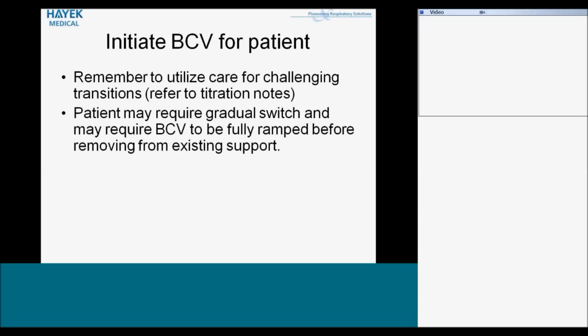So if you've got a patient that's unable to move air on their own at all, you don't want to remove them from their other means of support, whether it's non-invasive or invasive, until the Hayek has reached those full prescribed settings. So you want to give them some time. Allow the Hayek to ramp before you take off the other means of support, or you may have a patient that will fall into some real serious shortness of breath or desaturate.